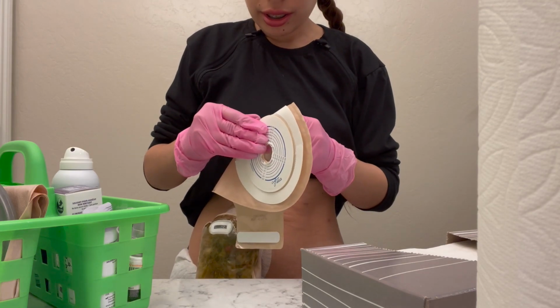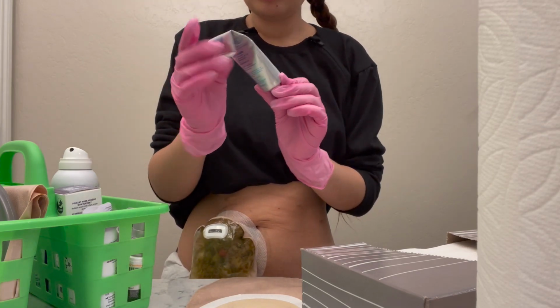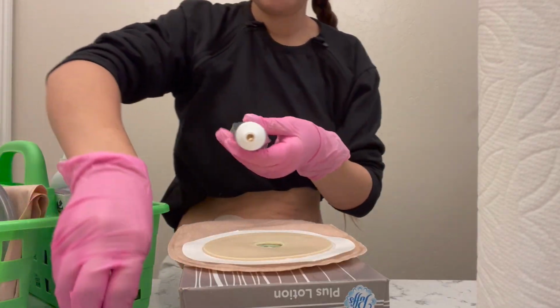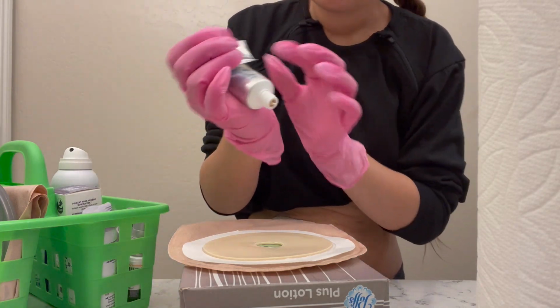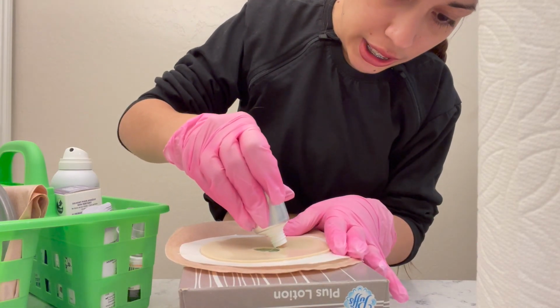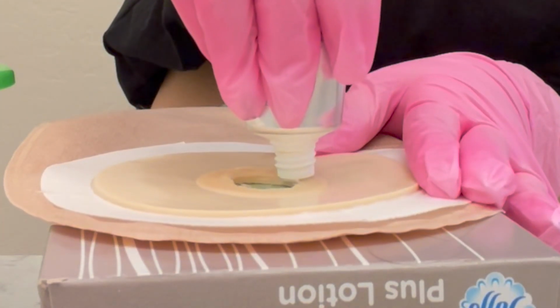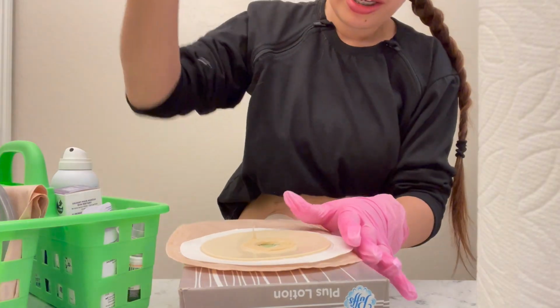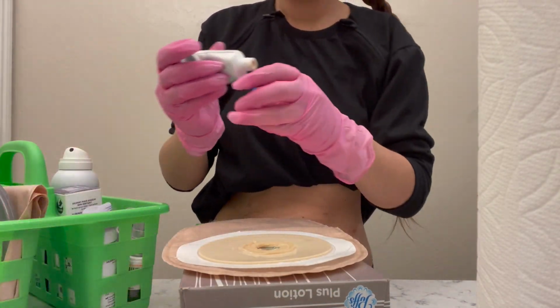And then I take this off, and what helps me to prevent any burns is I use the stoma adhesive, and I'll show you guys how I do it. It's really sticky, so I don't put it on myself. I actually feel better doing it this way, and this is the easiest way to prevent any leaks or burns or anything like that. Just go around twice, spread it out, and that's it. So now it looks like that. Not perfect, but easier.